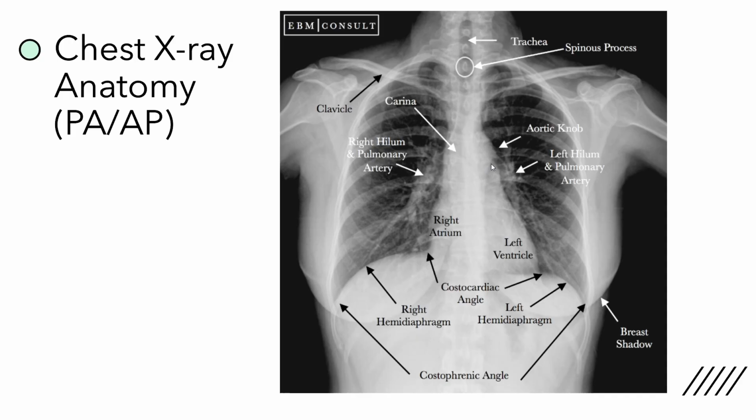We can also see an area that is a knob coming out right above the heart. That's called the aortic knob. It's just right where the aortic arch is curving around, that main principal artery that's bringing oxygenated blood out of the heart to the rest of the tissues.